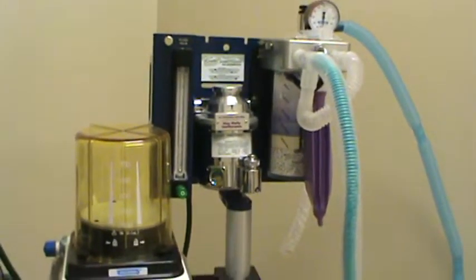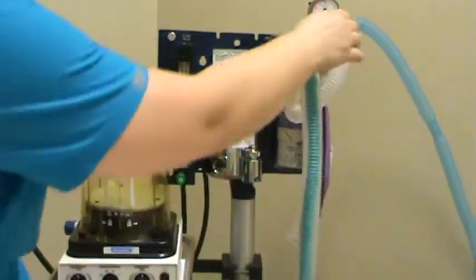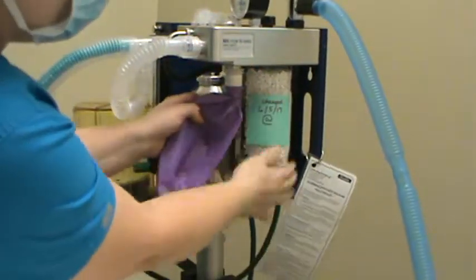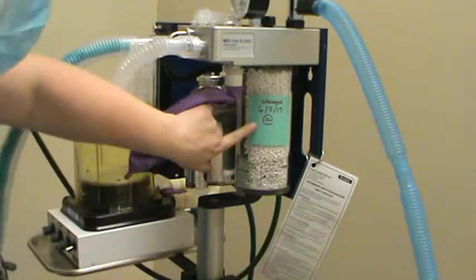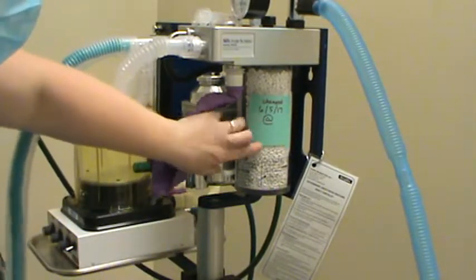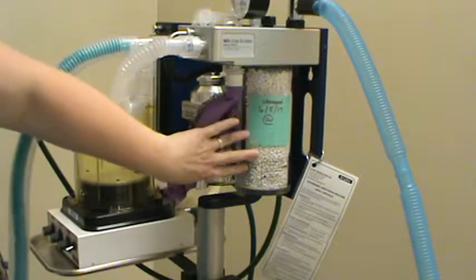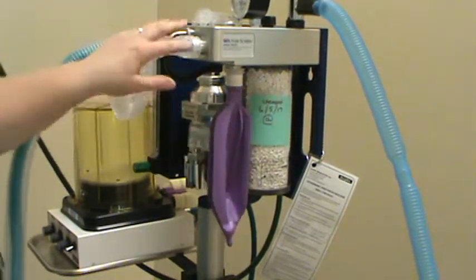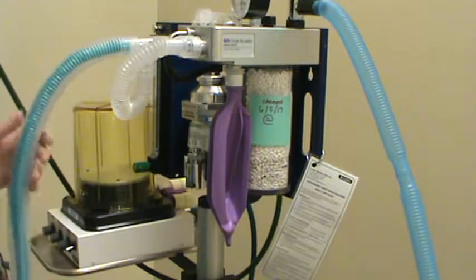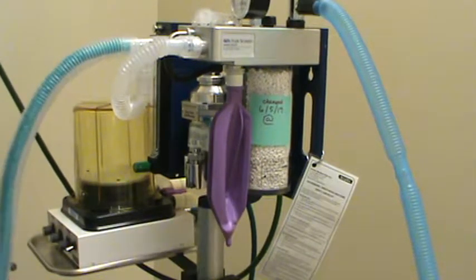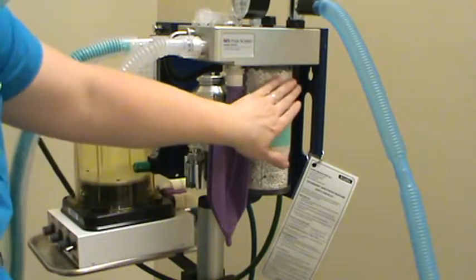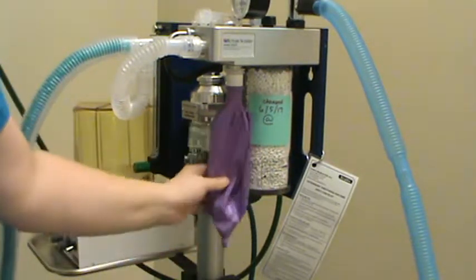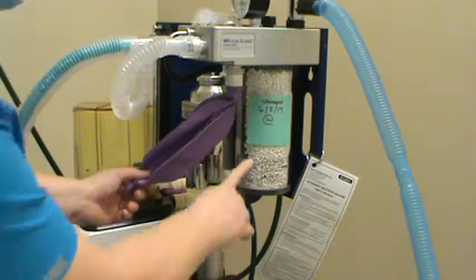Third thing we're going to check is our soda lime. We have our date that we changed that last. This is going to absorb the exhaled CO2 so the patient's not breathing it. We're going to use a rebreather today. This will actually take out all of that CO2 that is exhaled by the patient.